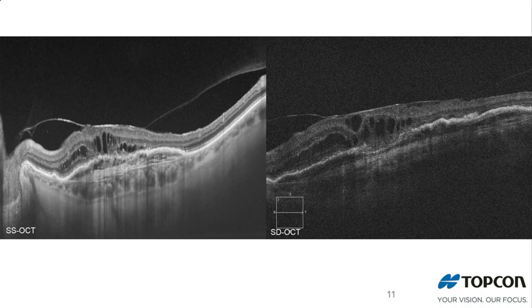Here, because of the medium-grade cataract he had, it becomes very, very noisy, and you cannot penetrate through the RPE. You certainly can't see anything of the choroid. Why do I always repeat the importance of the choroid? The choroid is where most of the diseases, it seems right now, start.